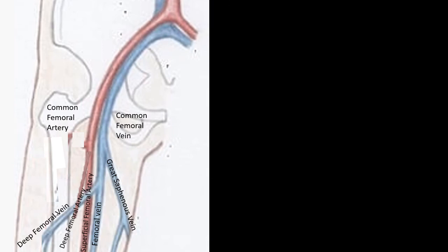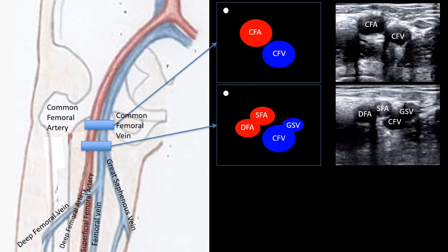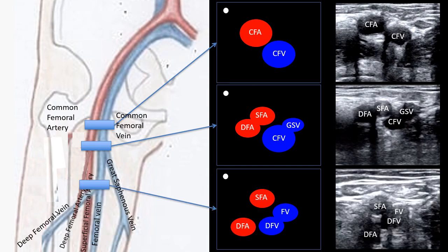The first point where we will obtain our images roughly corresponds to the femoral crease, or where the leg naturally bends. In cross-section, the common femoral vein is medial to the pulsatile common femoral artery. A short distance inferior to that, we will look for the offshoot of the great saphenous vein from the common femoral vein, which may occur slightly superior to or at the same level as the bifurcation of the common femoral artery into the superficial femoral artery and the deep femoral artery. Finally, inferior to that, we will look for the bifurcation of the common femoral vein into the deep femoral vein and the femoral vein.